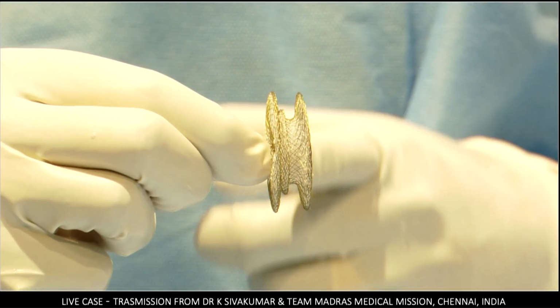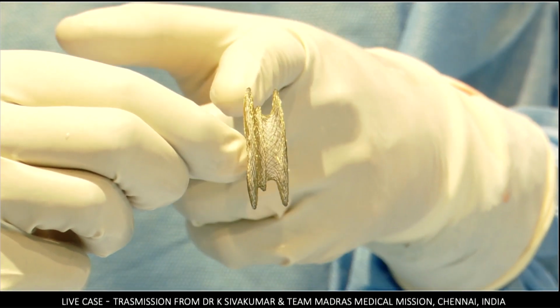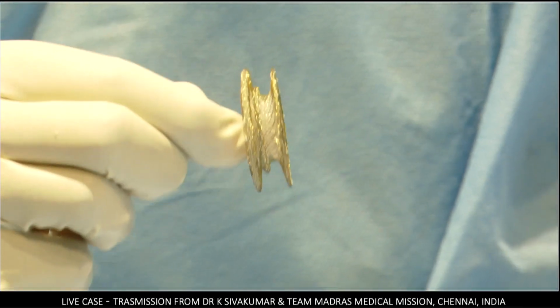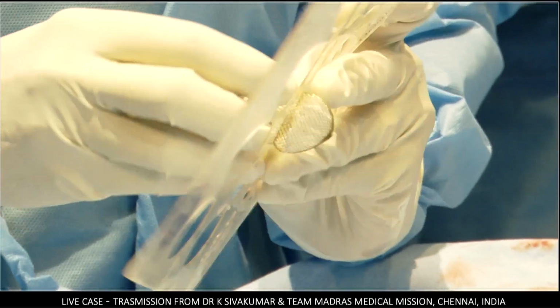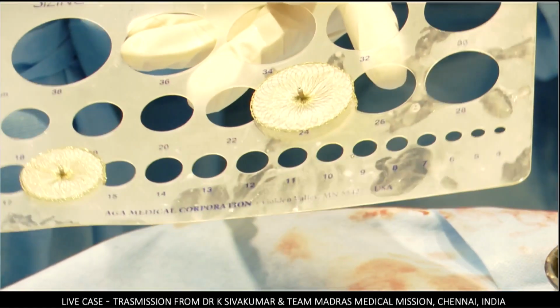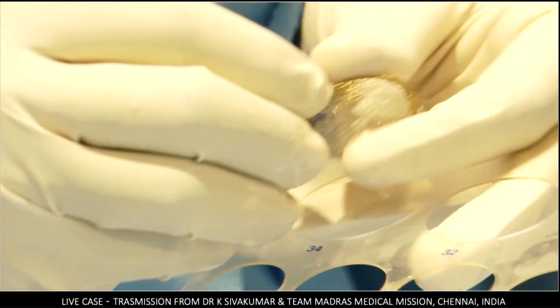There is a waist that runs 2 or 3 steps: a larger waist, an intermediate waist, and a smaller waist. So for example, this particular product can be used for a 24. It can be used for a 22.